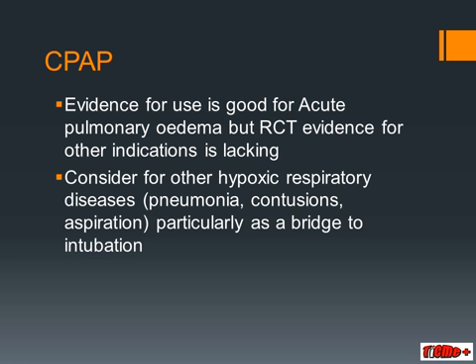and then you can methodically and safely get together your drugs and your equipment and your staff for a planned intubation. Your pre-oxygenation will be far better after a period of PEEP than it would be if you just laid the patient down and did a rapid sequence induction.